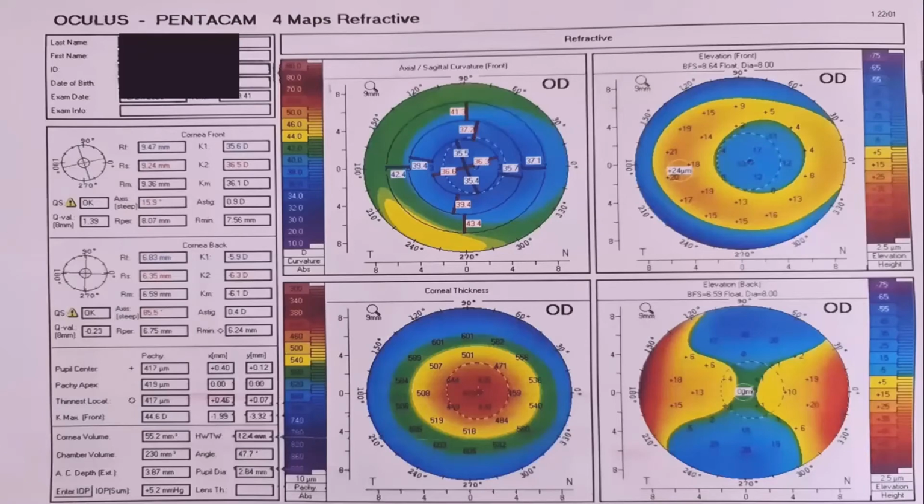For example, this is a case of post-LASIK ablation, but we can see here there is a central flat area of ablation. The Q value is plus 1.39. Central flat cornea surrounding the pupil. There is no decentration. Anterior elevation is minus 13. There is no posterior elevation. There is a thinning, which is expected. So this is a case of normal post-LASIK myopic ablation.